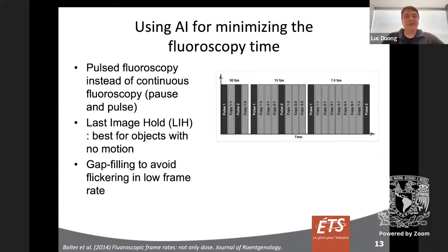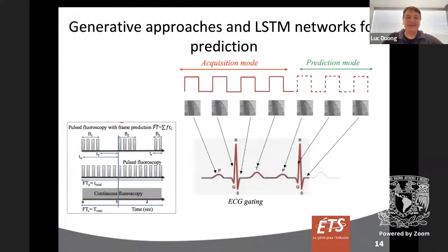I've been told that a very long time ago, to evaluate these kinds of techniques, when the fluoroscopy was continuous, they used a round metal plate with a hole in it, rotating just underneath the fluoroscopy. So the plate was protecting the patient when it was turning around, and it was the same effect as here. So you only have images at different times. That was interesting, I think, to see.